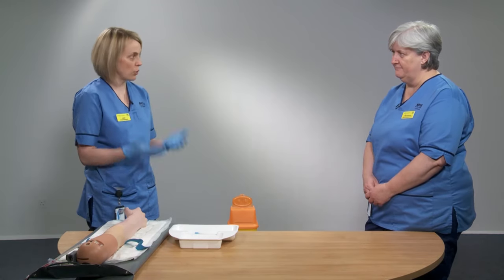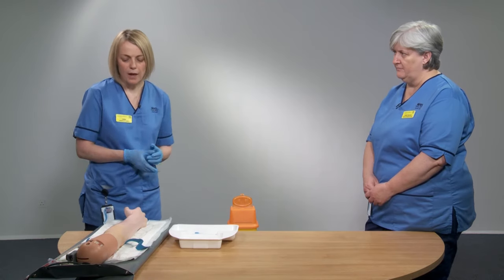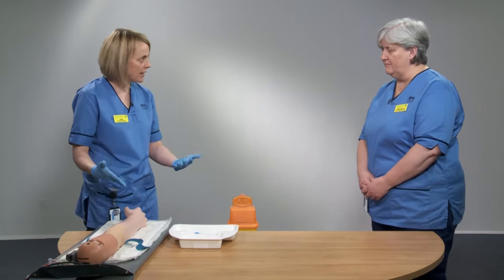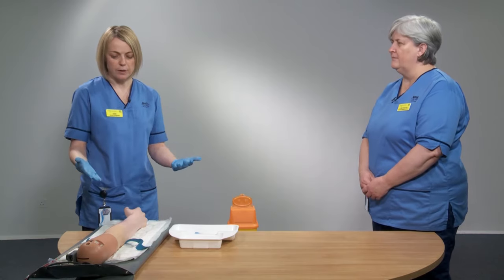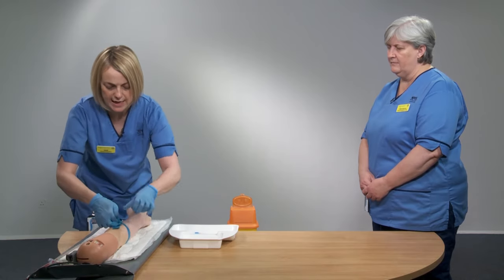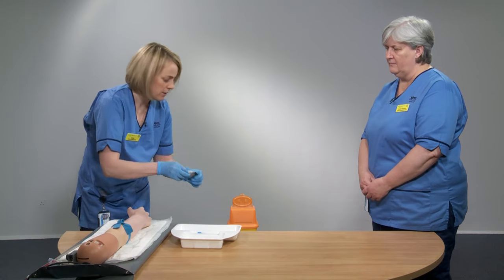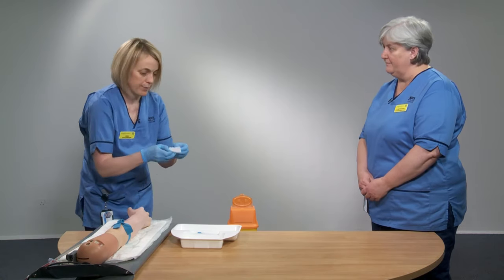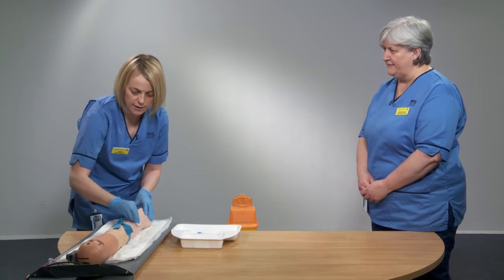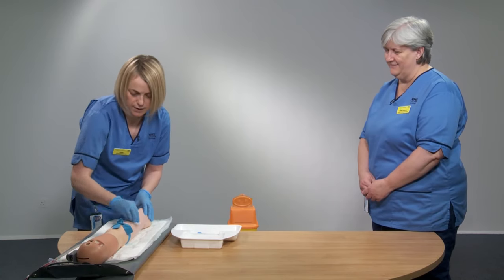The next device is the quick shield, which is slightly different to the butterfly. However, the beginning of the process is exactly the same: obtain patient consent, ensure patient comfort, apply the tourniquet, and clean the skin. Apply the tourniquet, then clean the area thoroughly with the clinical wipe for 30 seconds — 'think 30' — using the lattice pattern, and allow it to dry.